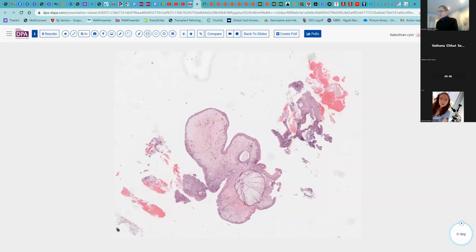We welcome you. We have a great opportunity to talk today about some cervical lesions, as well as some lesions in the vagina. We'll talk about epithelial lesions and some stromal lesions. And we're very glad that you could be with us. And as I mentioned earlier, if you have questions as we go along, please feel free to type them into the chat. We'll take time as we go along or at the end to try to answer your questions.